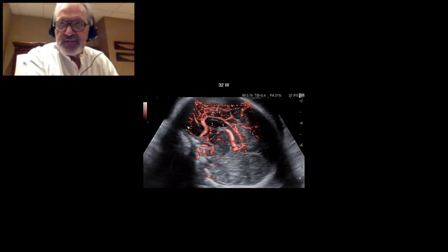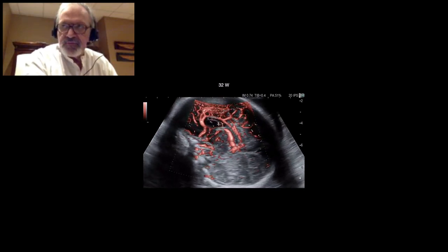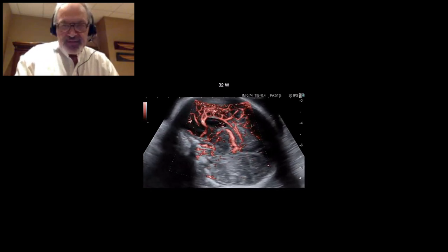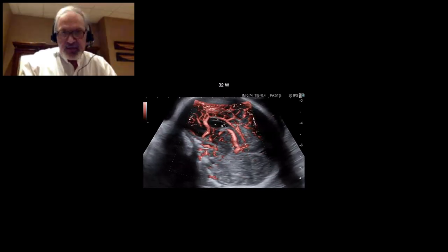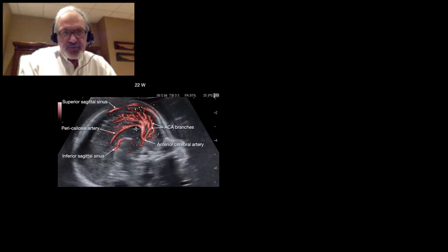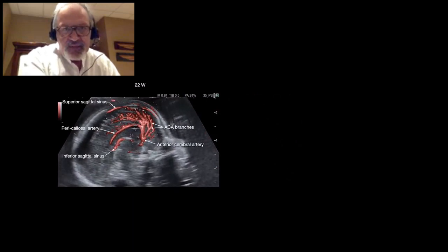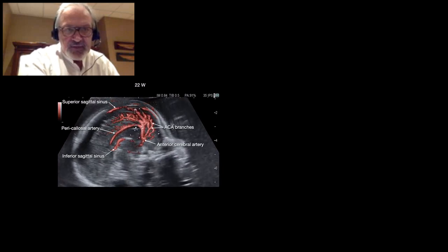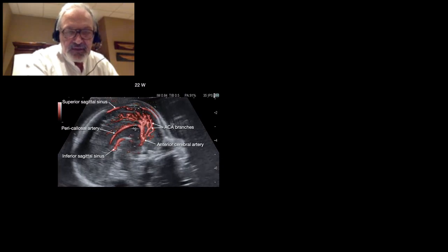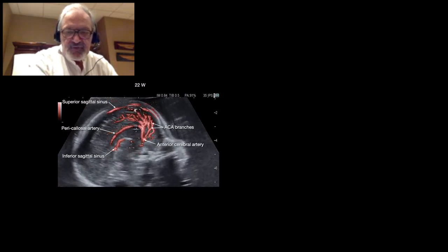The brain vascularization is also a good example to show the contribution of DFI. We can easily reveal the entire pericalosal artery and its branches, as you can see here. We very often get this picture because it's not very difficult to catch. Here, at 22 weeks, we can see very easily the anterior cerebral artery and its branches, frontal branches, as well as the pericalosal artery and the inferior sagittal sinus. Just under the skull, you can see the superior sagittal sinus, in which the flow is very, very low.